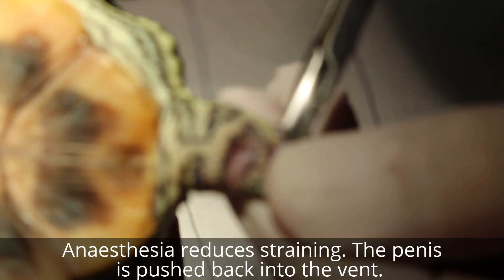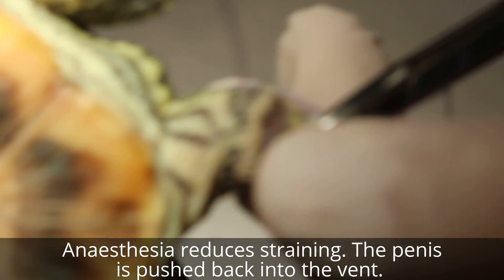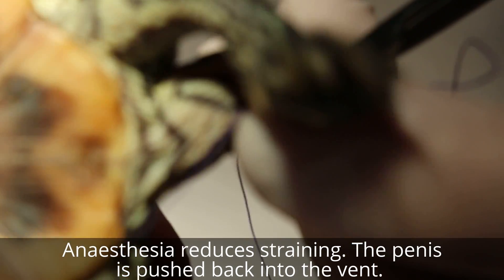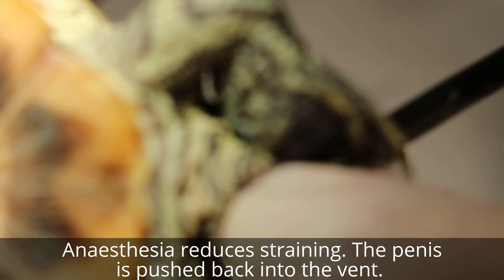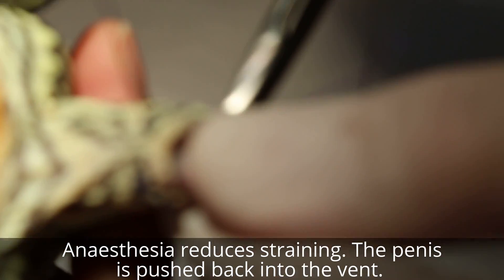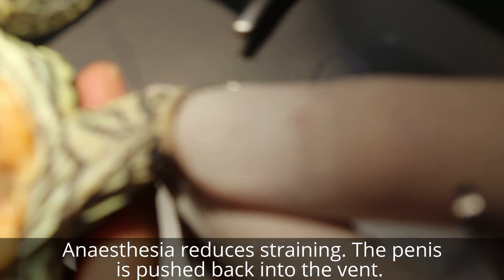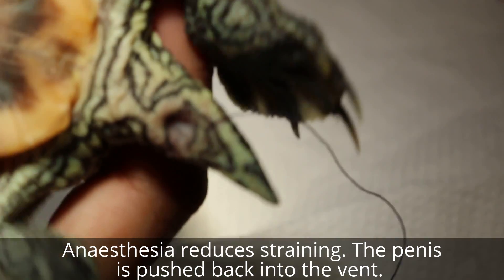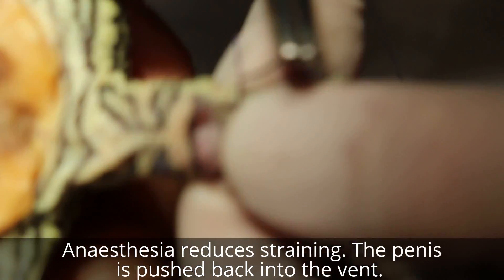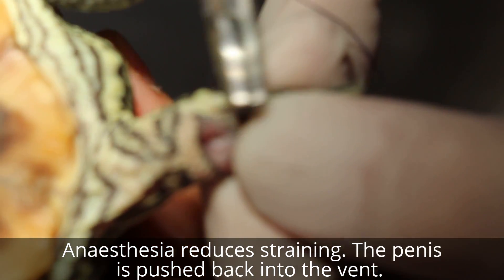Basically it is a vent - the peri-cloacal area. It's moving so a bit more gas. Just turn it. You can see without anesthetic it's very difficult to do - with anesthetic at least there's not so much movement.